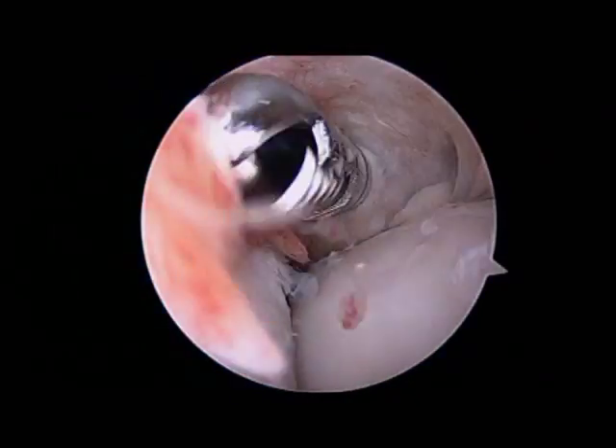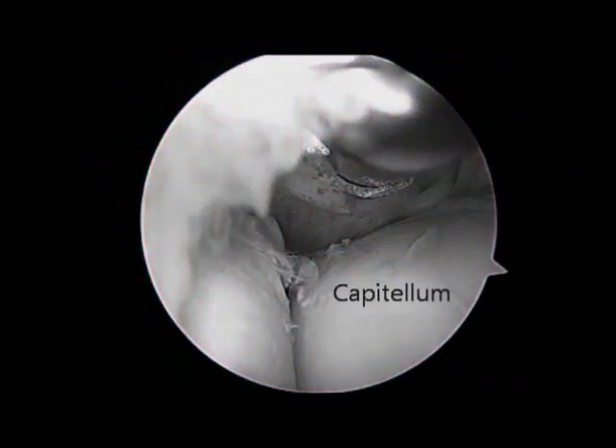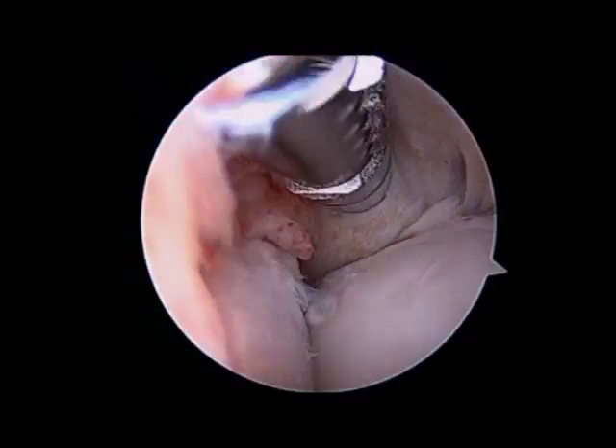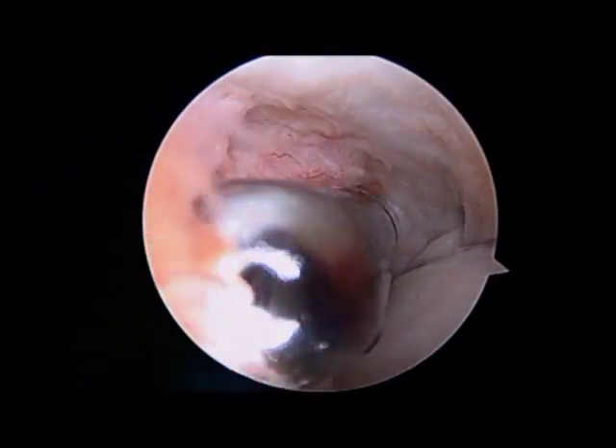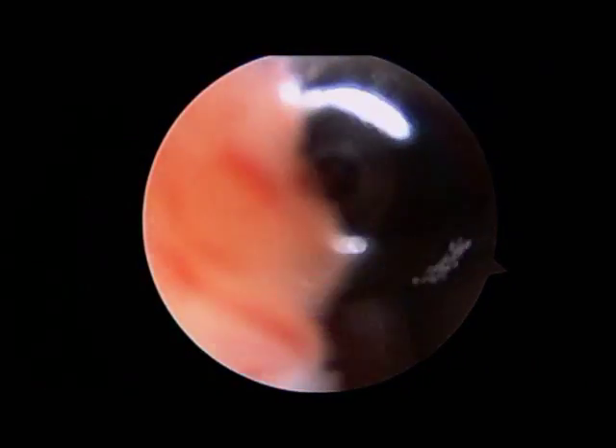This is the front half of the joint, which is inspected for loose bodies. You can see the capitellum to the right and the radial head to the left. The shaver is used to clear out all of the synovium — that red, friable tissue to the left — to allow a thorough inspection.